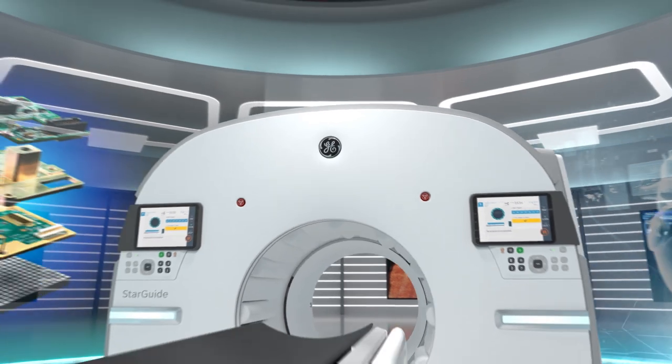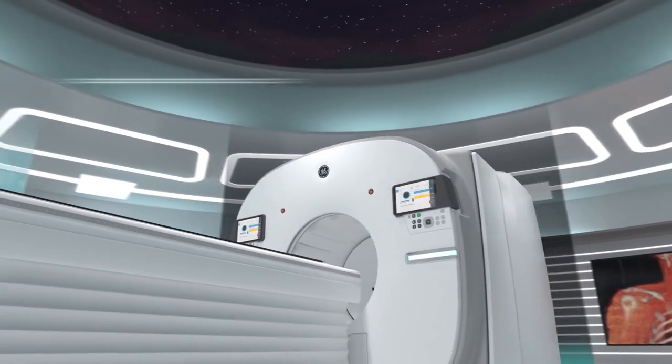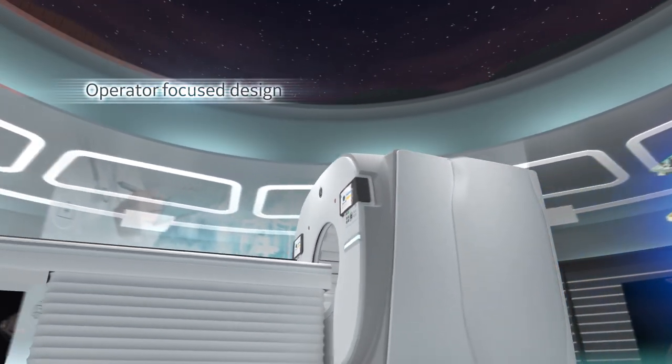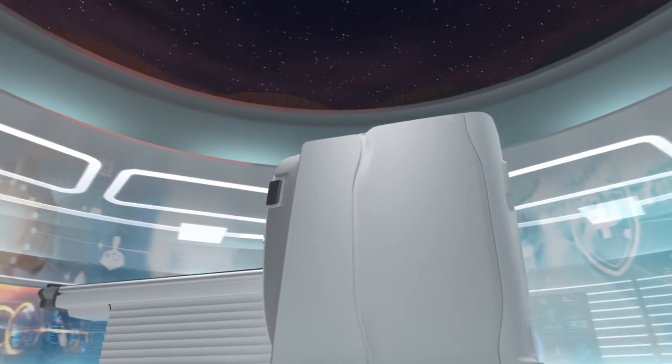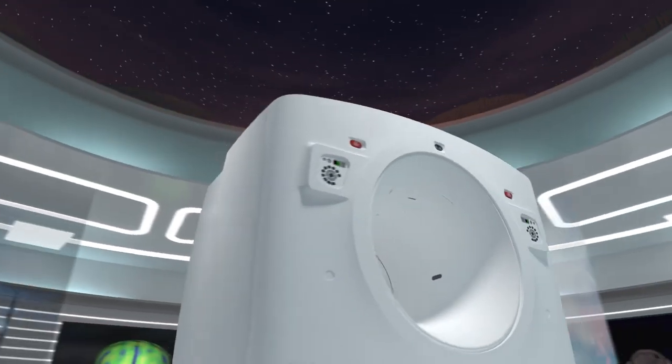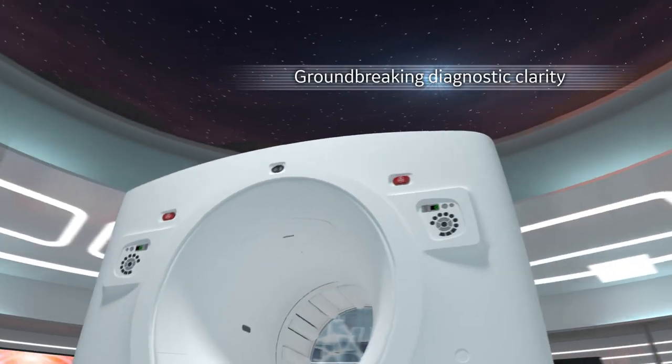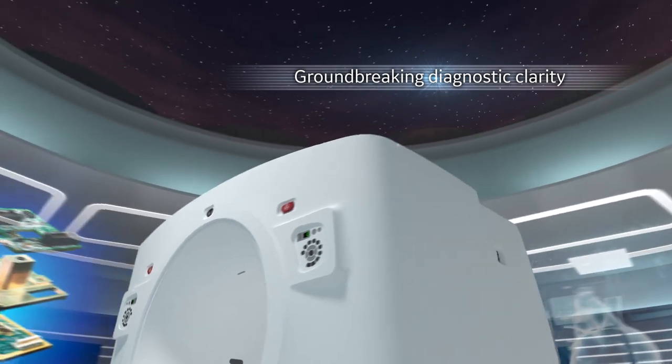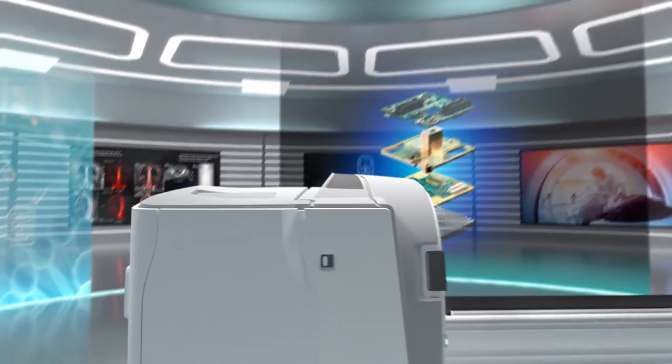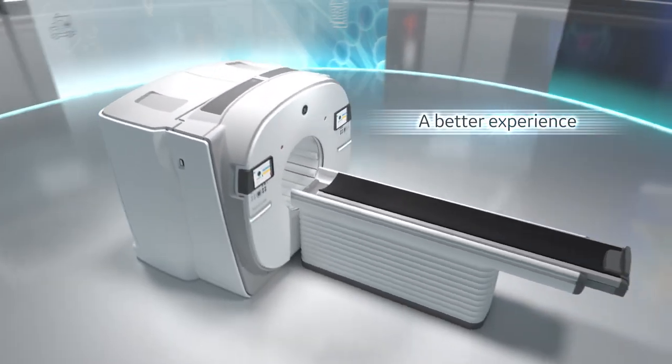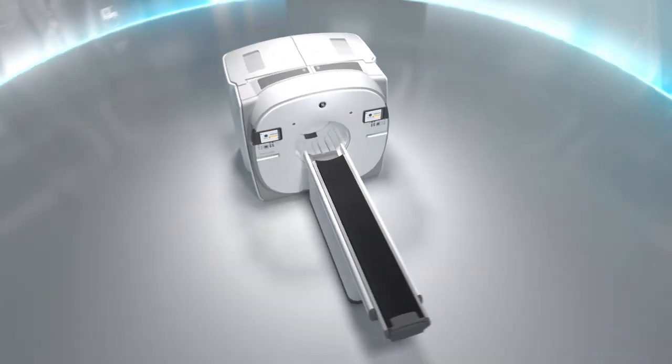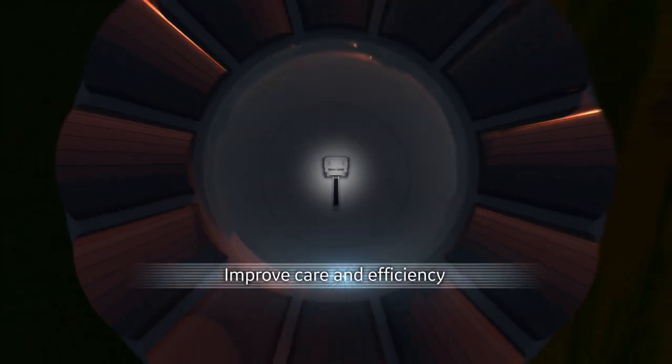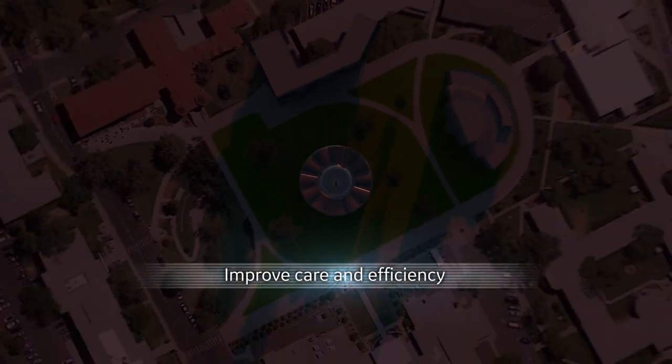Pioneering advancements include operator-focused design, optimizing balance between sensitivity and resolution with groundbreaking diagnostic clarity, minimizing patient time on the camera for a better experience, enabling critical outcomes to improve care and efficiency at the same time.